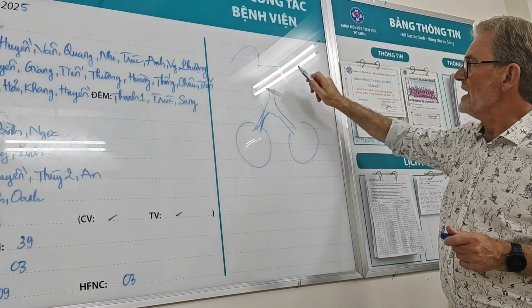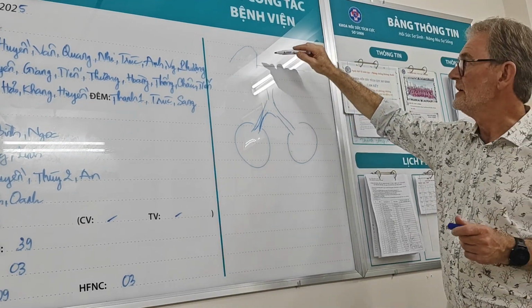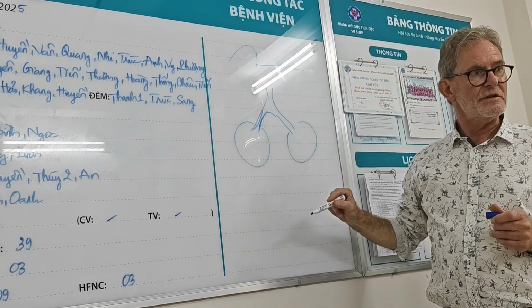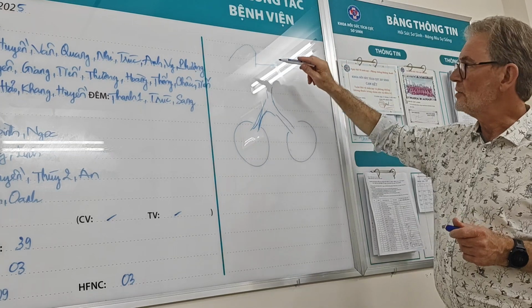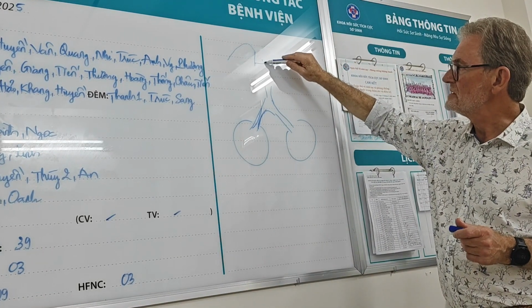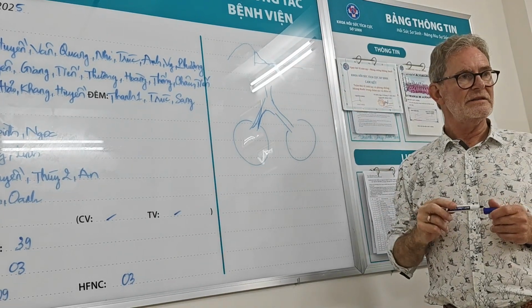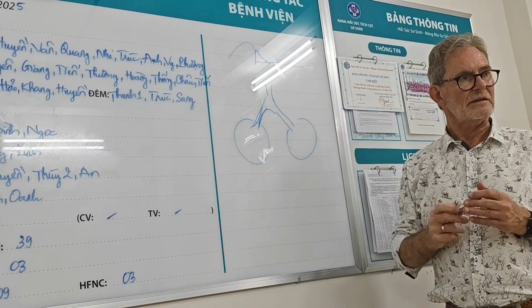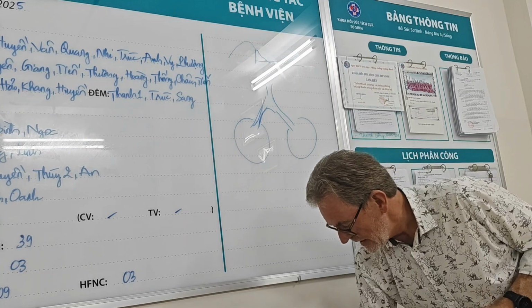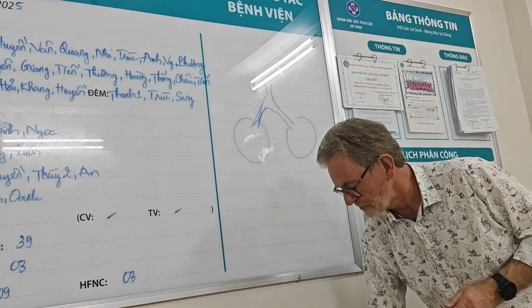When you see that type of flow wave when you ventilate, it means your inspiratory time is too short. So what you do is you gradually increase the inspiratory time until you see the ventilator curve come back to zero again.